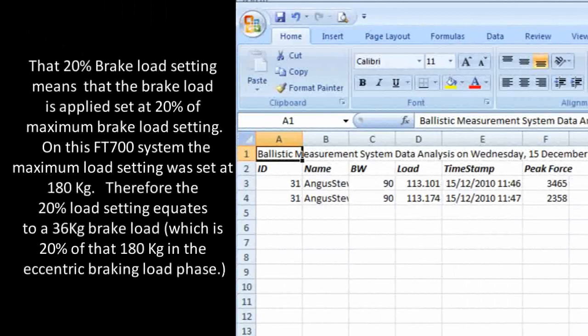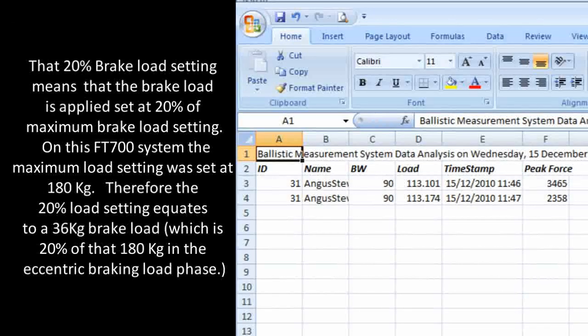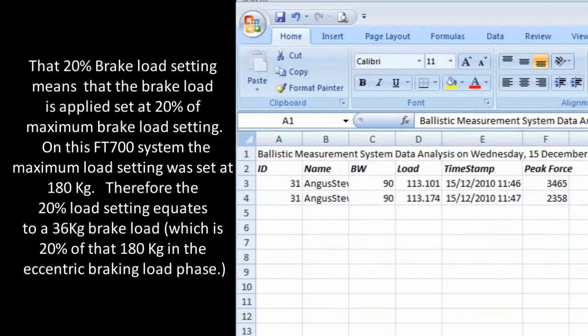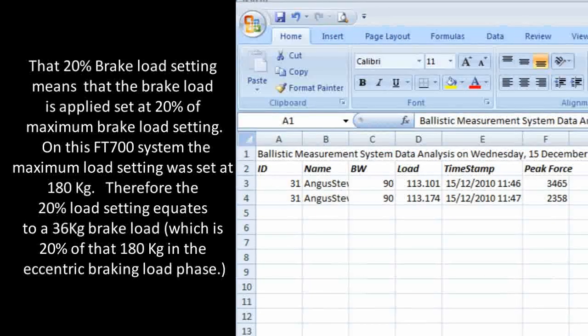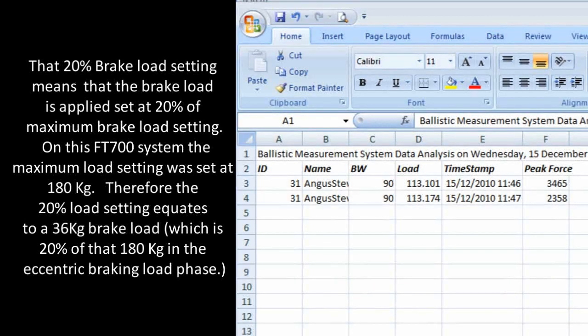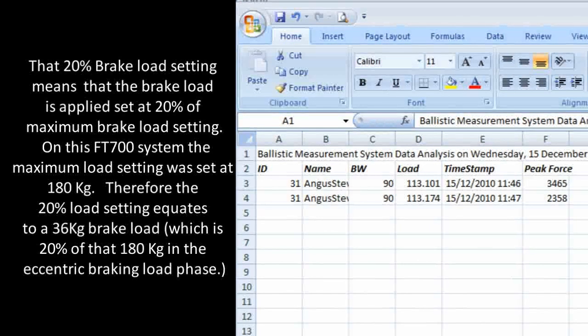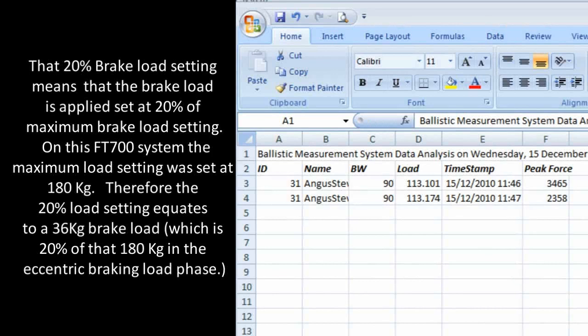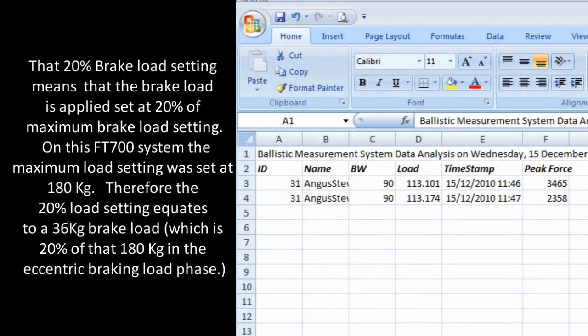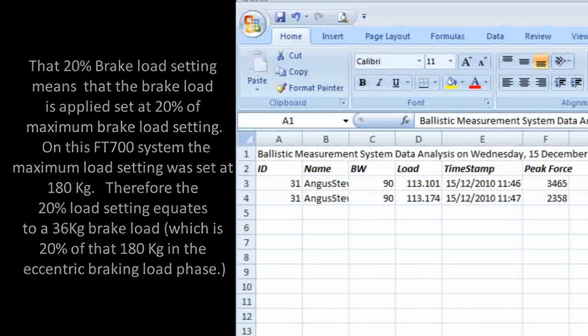The 20% brake load setting means that the brake load is applied set at 20% of maximum brake load setting. On this FD700 system, the maximum brake load setting was set at 180kg. Therefore, the 20% load setting equates to a 36kg brake load, which is 20% of that 180kg in the eccentric braking load phase.